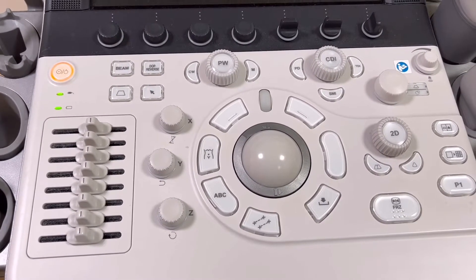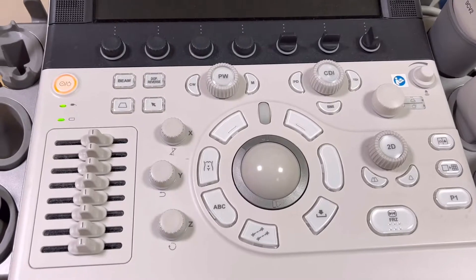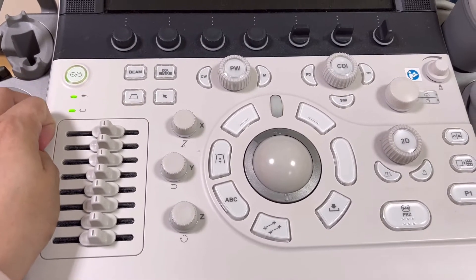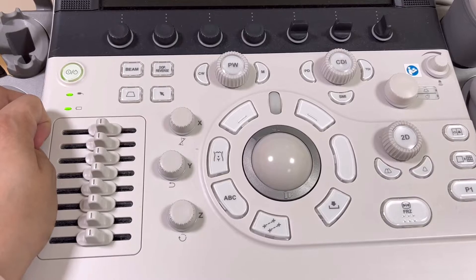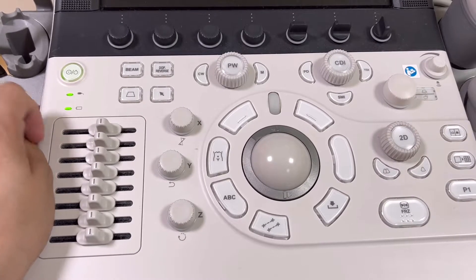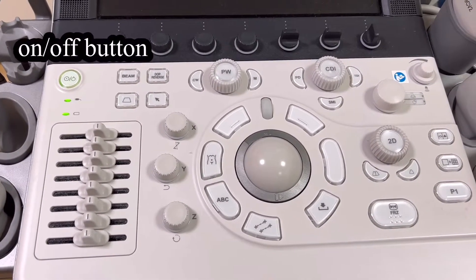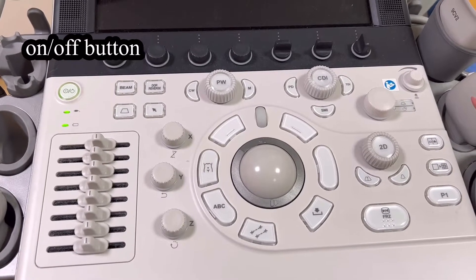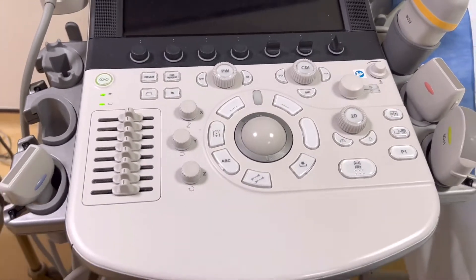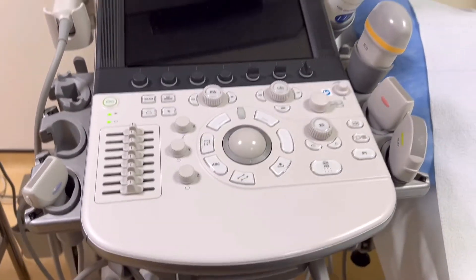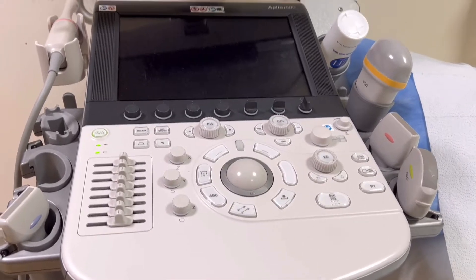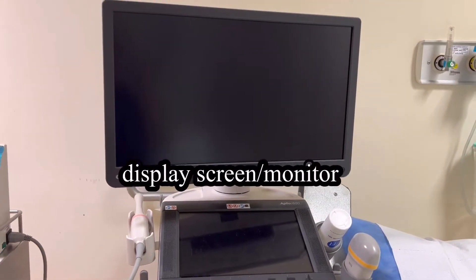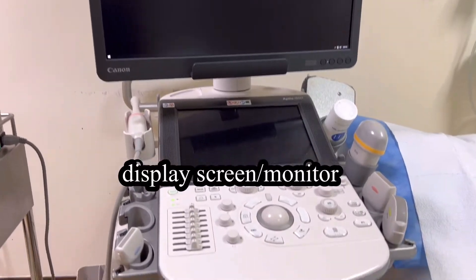So let's begin. In essence, this is the ultrasound control panel — the area where the essential knobs and buttons are located. This is the switch for on and off. And then this is the display screen on which your acquired pictures or images are shown.